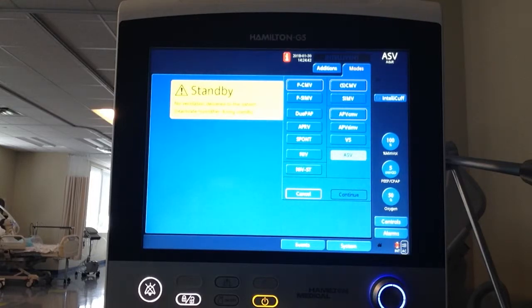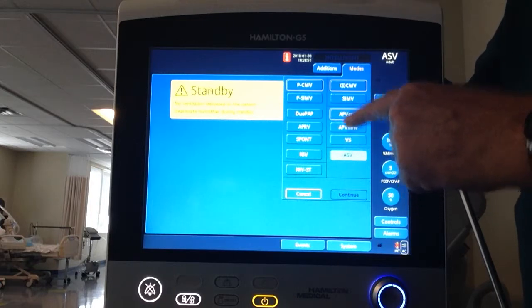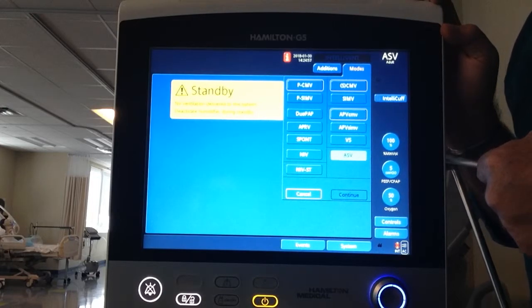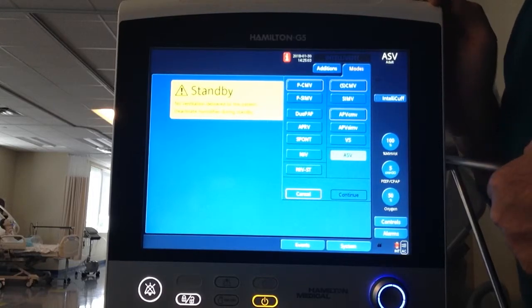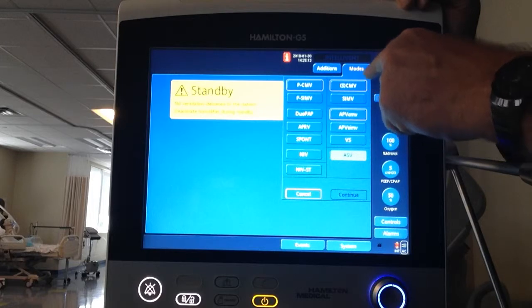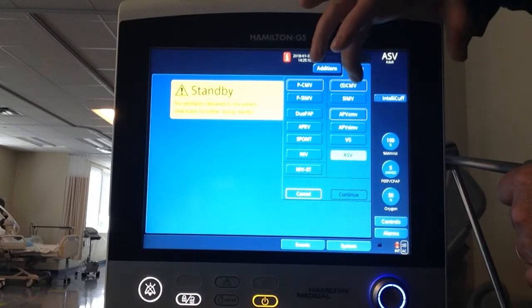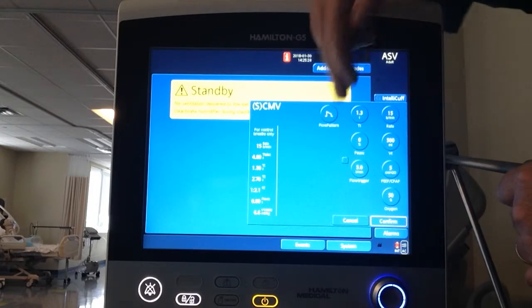We want to ventilate with volume. On this side you can see the first one is SCMV - Synchronized Continuous Mandatory Ventilation. As I've told you, many ventilators can no longer call it assist control because of copyright laws, so this is just another name we have to remember. Then you have SIMV. These are the only two modes for this video, so I'm going to hit CMV, then hit Continue.